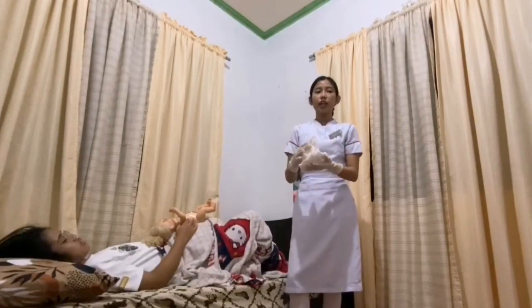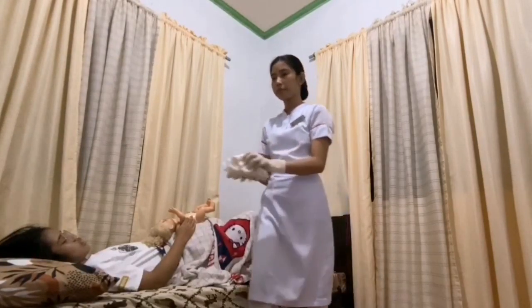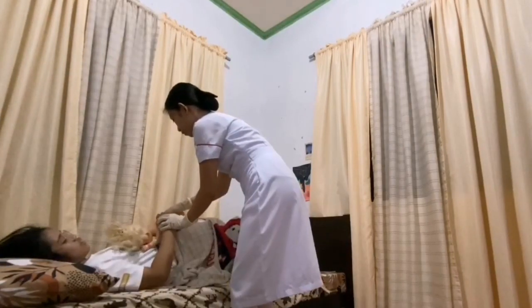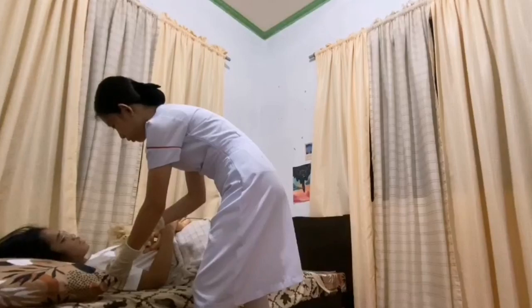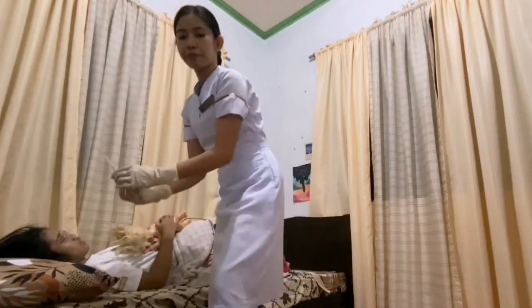So after that is to palpate the mother's abdomen. Give 10 IU oxytocin intramuscular to the mother. Watch for vaginal bleeding. Change gloves if not possible. Wash off the gloved hand or remove the first set of gloves. Since I have done the double gloving step, the next thing that I am going to do is to remove the first set of gloves, assuming that I have already removed it.